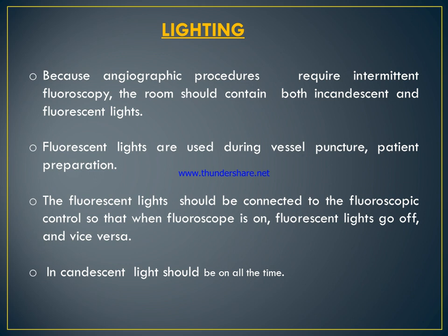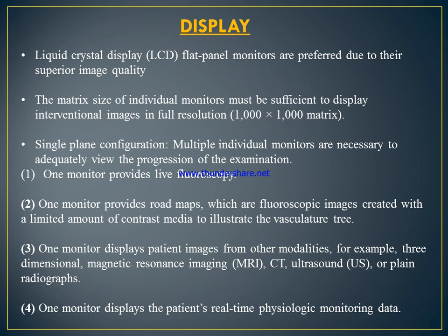Fluorescent light should be connected to the fluoroscopic control, so that when fluoroscopy is on, fluorescent light is off, and when fluorescent light is on, fluoroscopy is off. Means one is on, the other is off. Incandescent light should be on all the time.